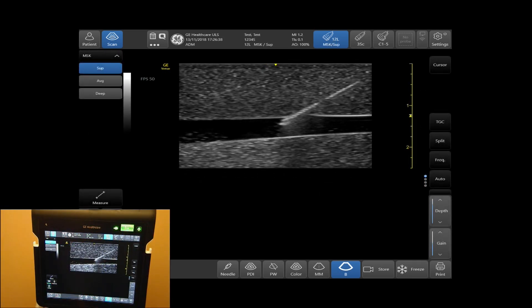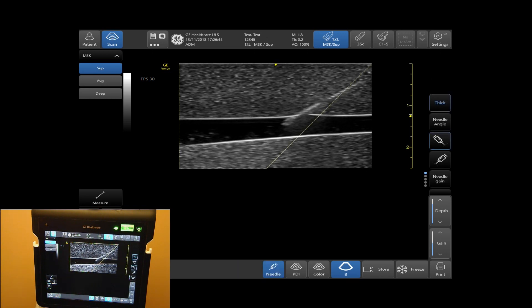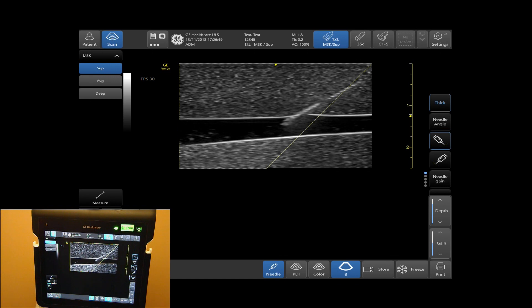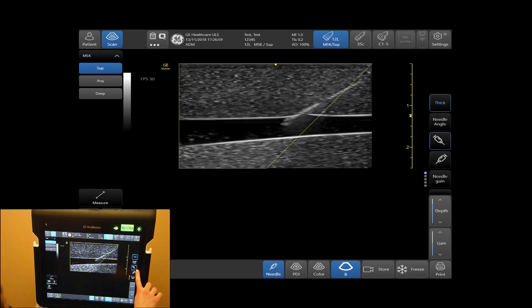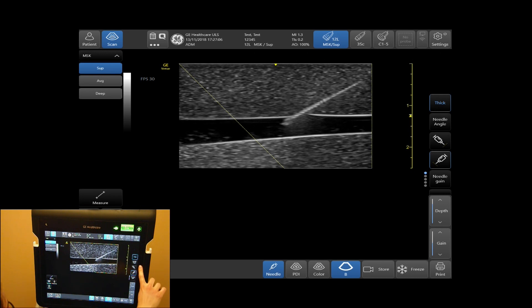To activate needle, tap needle on the bottom of your screen. The needle recognition software enhances your needle visualization. Be mindful to keep the region of interest within the dotted lines. Use the proper steer and angle by using the needle icons to change from left to right, and the needle angle to change the angle of the beam.